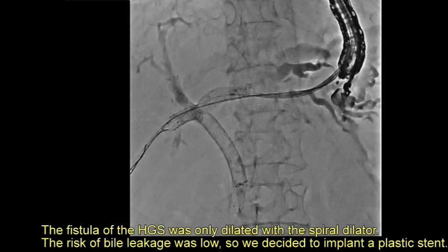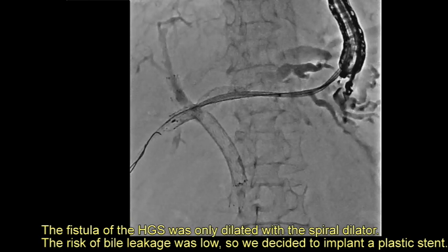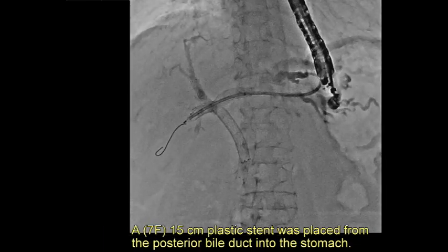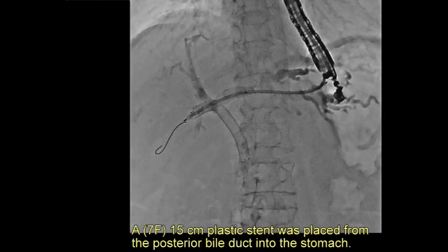The fistula of the hepatico-gastrostomy was dilated using a spiral dilator only. The risk of bile leakage was assessed as low, so a decision was made to implant a plastic stent. A 7-French 15 cm plastic stent was placed from the posterior bile duct into the stomach.